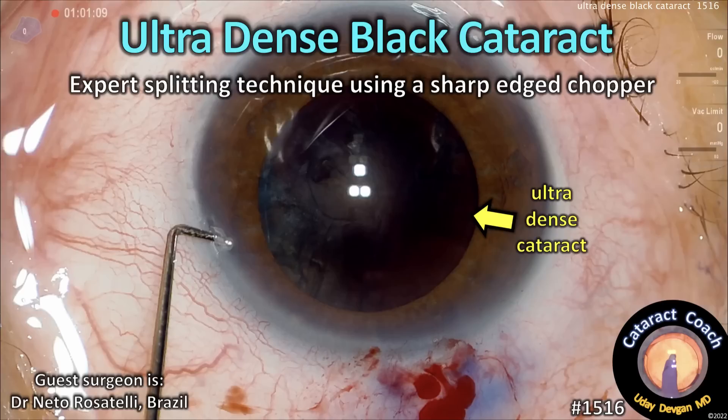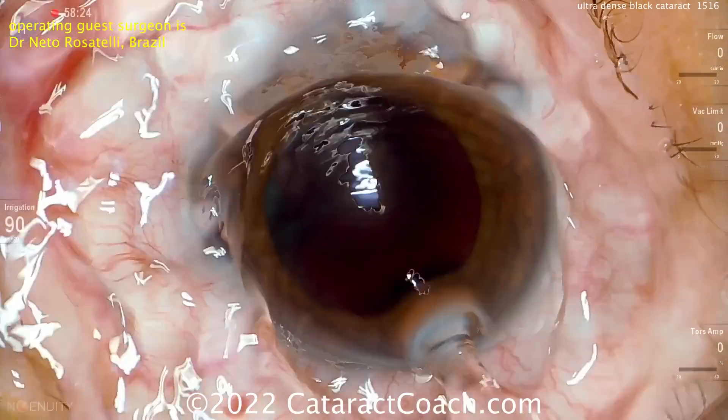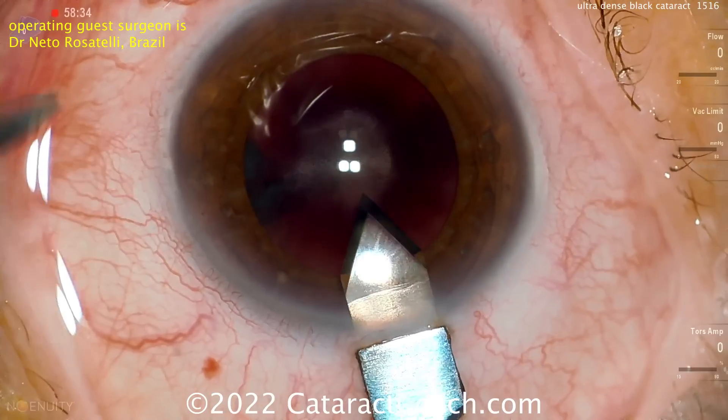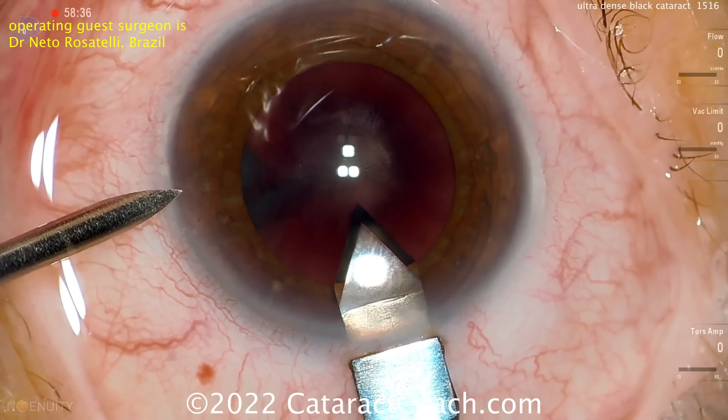CataractCoach.com — ultra-dense black cataract. Here's an expert splitting technique using a sharp-edged chopper. Our guest surgeon is Dr. Neto Rosatelli from Brazil, a fantastic surgeon. We've featured his videos here before — always a pleasure to learn from him.